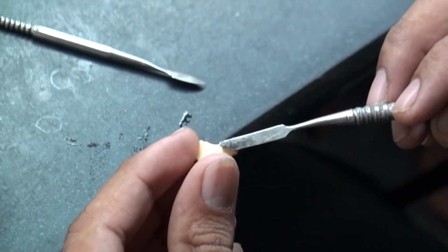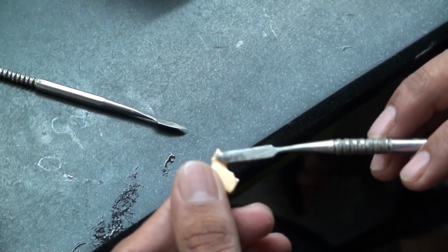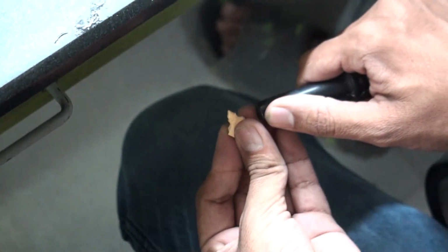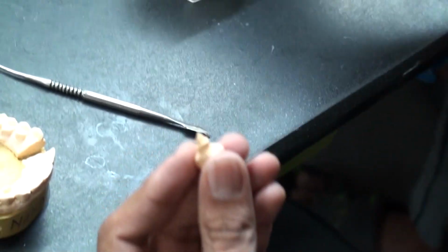So that's a bit of hardener going on. And then he's also going to use a separator as well. Now I'm not sure, to be honest, which one he used first, either the hardener or the separator.